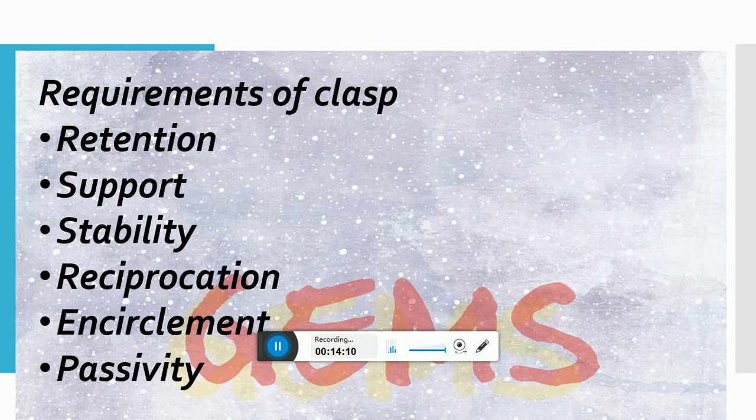I want you to know something about flexibility. Flexibility is the amount of retention.